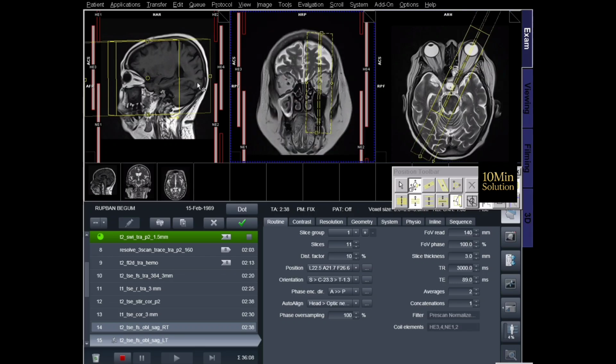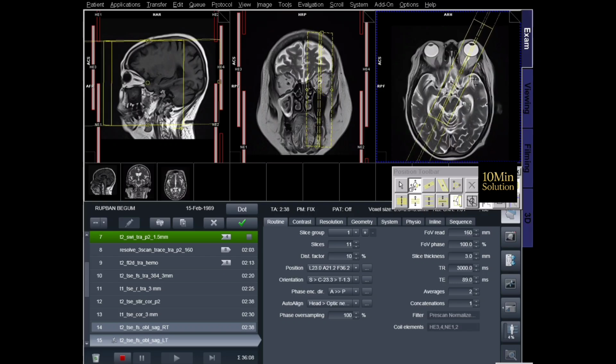Important MRI sequences. Several MRI sequences are used to evaluate orbital structures effectively. T1 weighted imaging, T1WI. T1 weighted images provide excellent anatomical detail. In T1 images, orbital fat appears with high signal intensity, while the optic nerve demonstrates intermediate signal intensity. This sequence is useful for evaluating anatomical structures and detecting hemorrhage or fat-containing lesions.